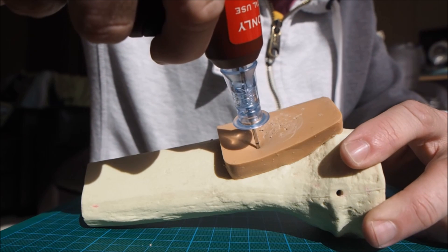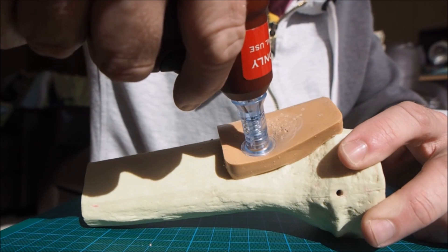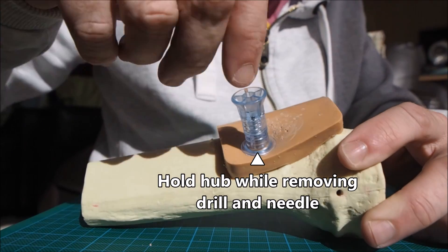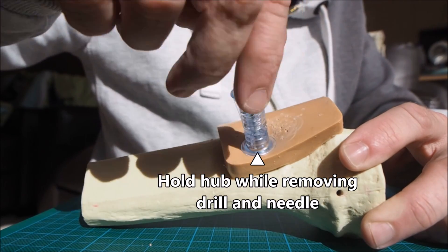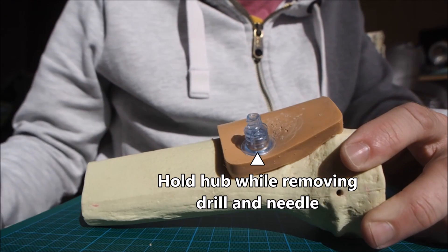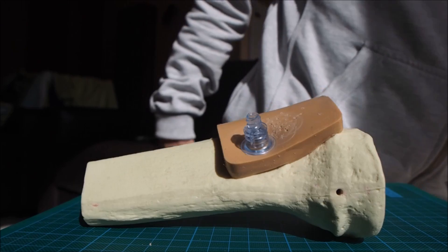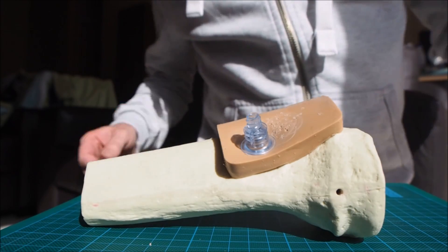So let's go. You can hear the change in tone there — all done. We can then unscrew the needle and leave the cannula in situ. That goes in a sharps container, so sharps are now clear. And we've got our intraosseous access.